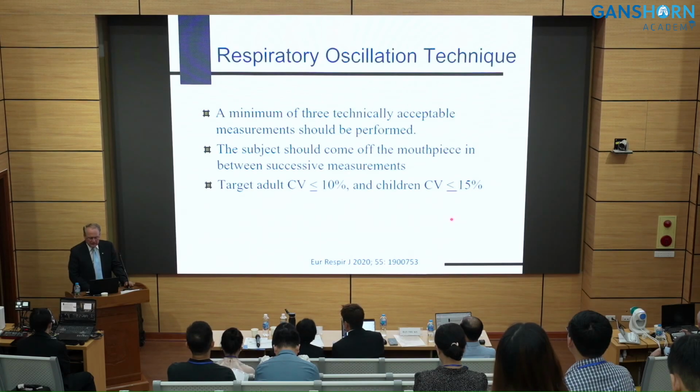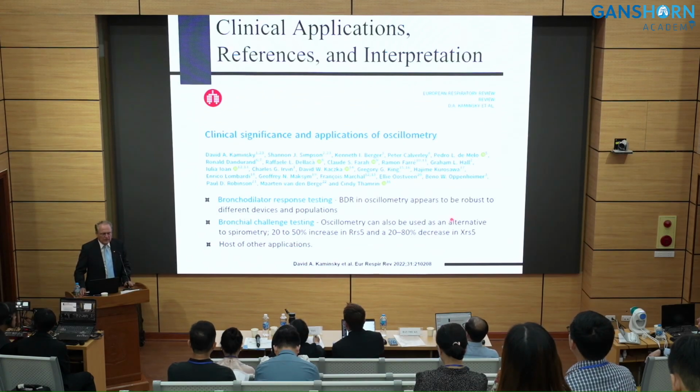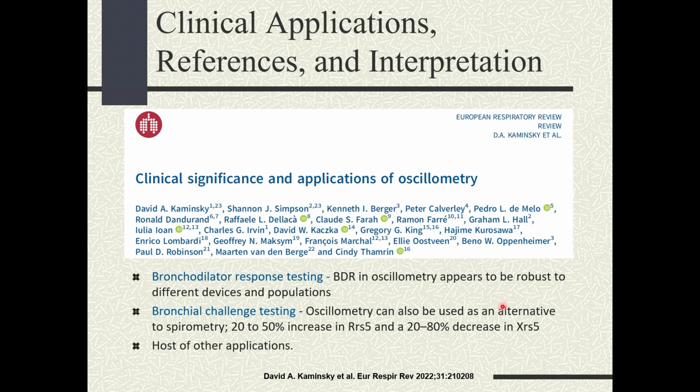If we look at that article that was published by David Kaminsky and colleagues, he goes through the various scenarios of where oscillometry may have an application. And I'm not going to be able to go through all those various applications, clinical applications or uses, but I did want to point out 2 in particular.